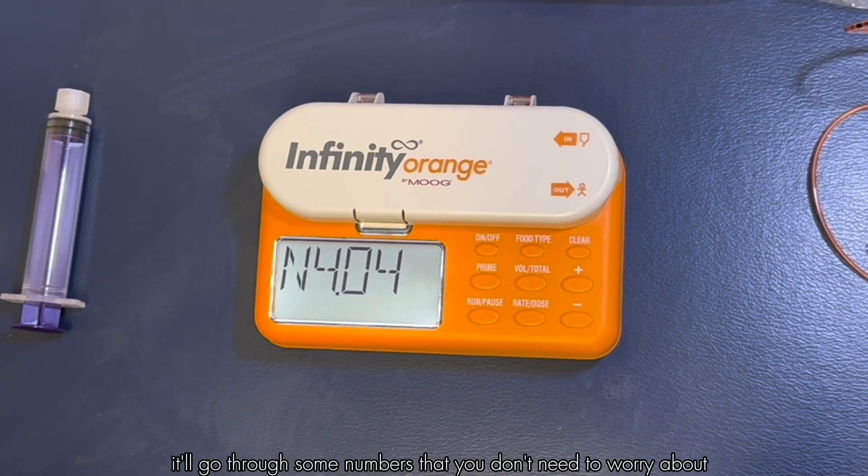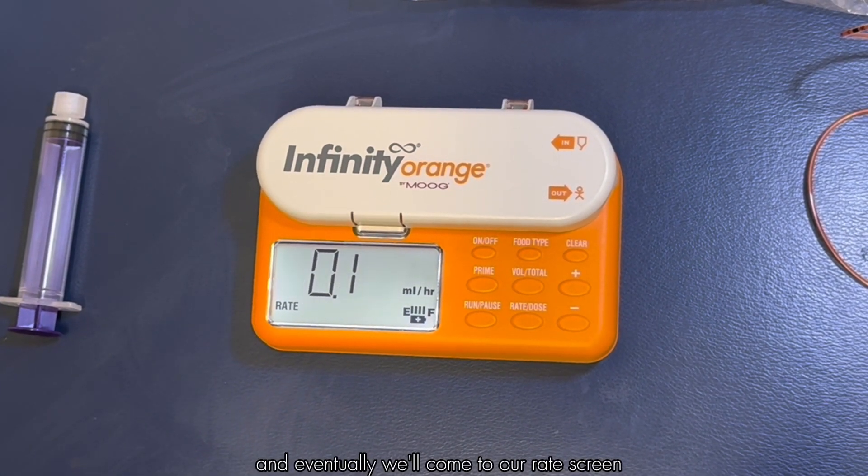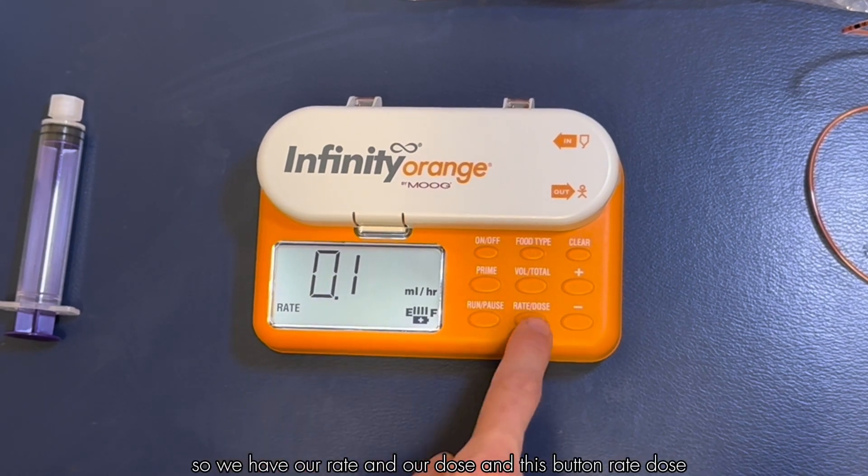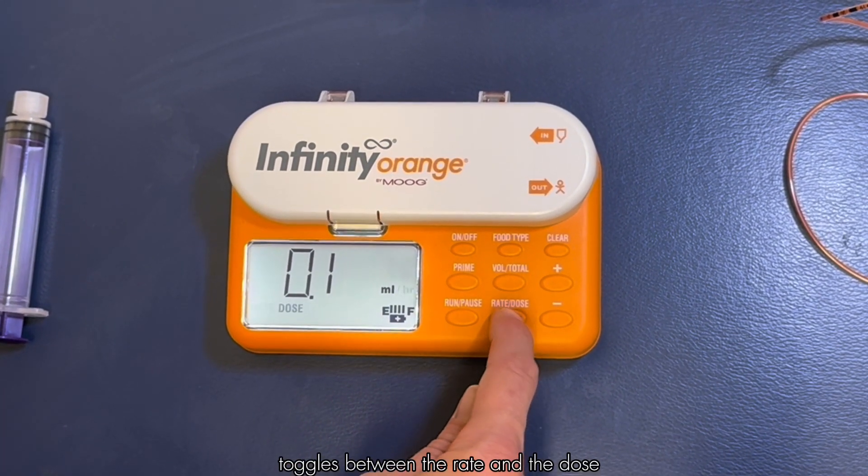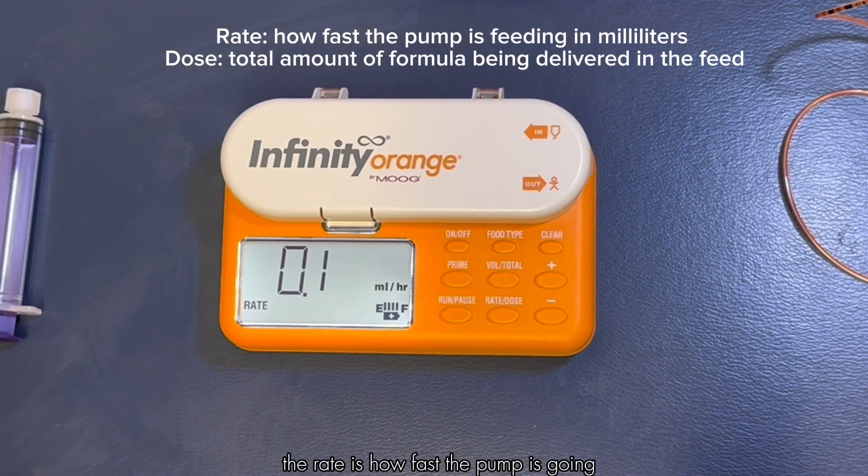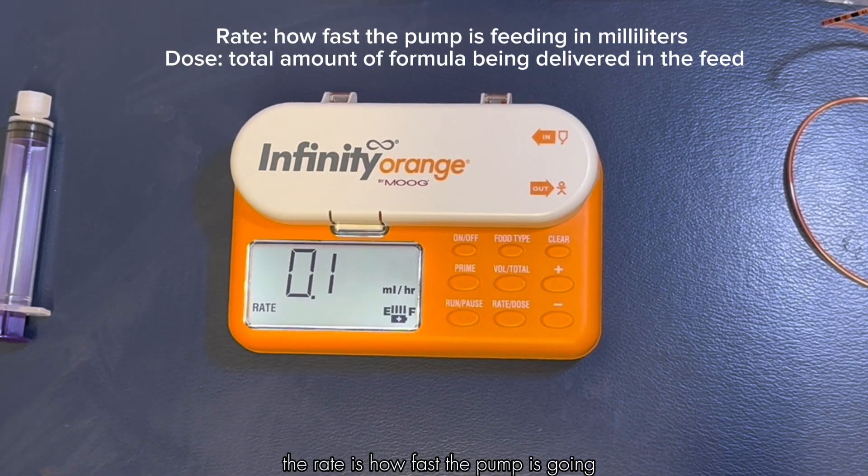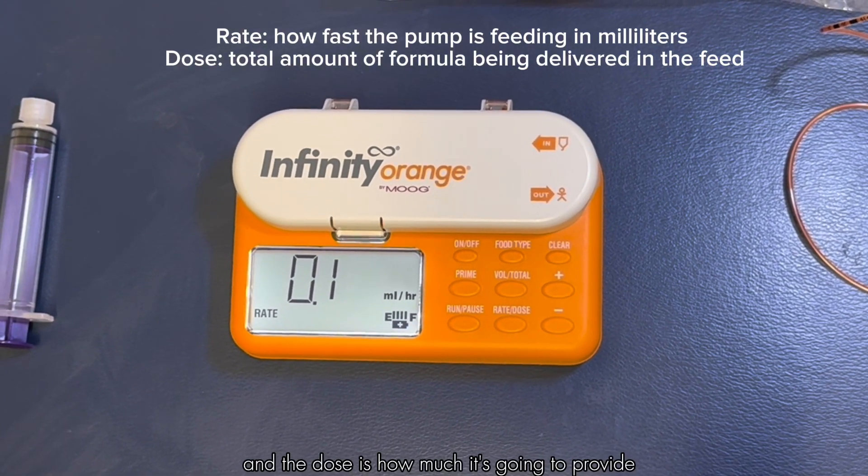It'll go through some numbers that you don't need to worry about and eventually we'll come to our rate screen. We have our rate and our dose, and this button toggles between the rate and the dose. The rate is how fast the pump is going and the dose is how much it's going to provide.